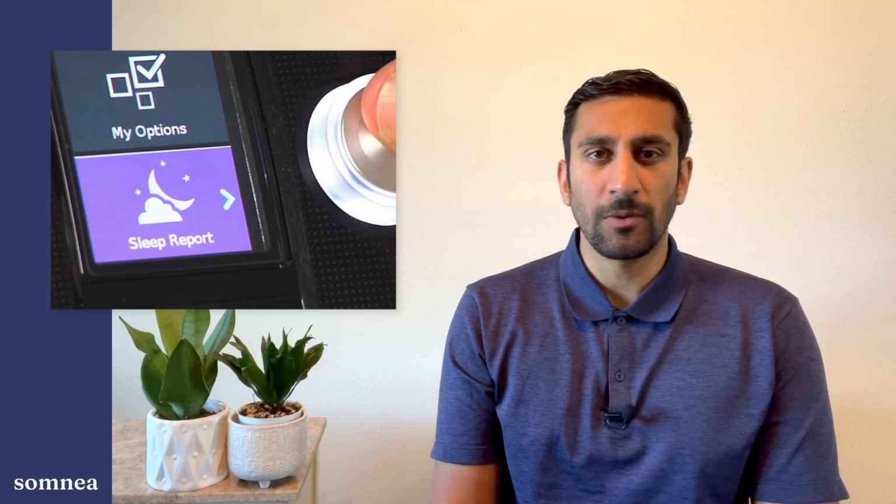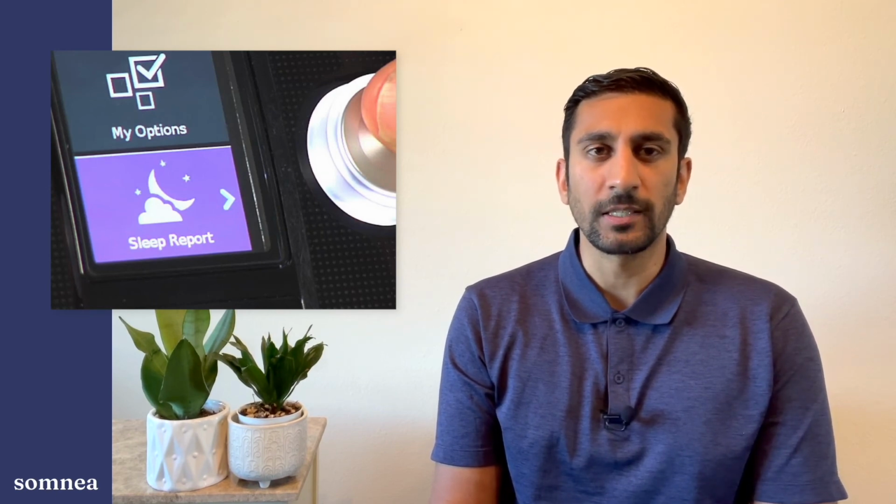The numbers are often reported directly on the CPAP machine itself. After completing a sleep session, many machines will display this information right on the machine screen for you to view. Otherwise, you can typically find this information by navigating through your machine's menu. Another spot to find this information is through your CPAP machine's dedicated mobile app. These apps allow you to view this information and sometimes additional info as well. You can view a single night or track your information over time.